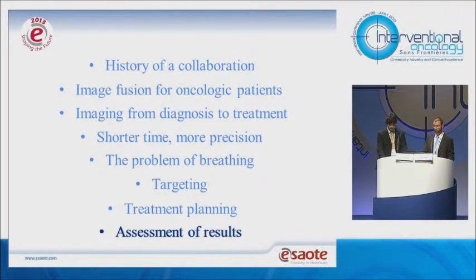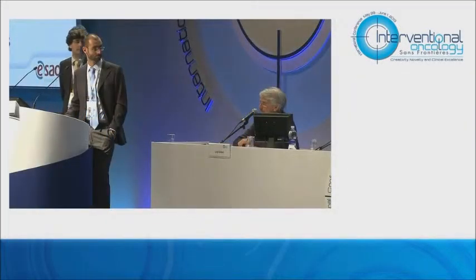Finally, the last point is how we can assess the results of ablation, possibly immediately, because the assessment should be done during the procedure, immediately at the end, when the patient is still in the interventional room or in the operative room. If you assess the result very beautifully, but 24 hours later or 48 hours later, and the lesion is not completely treated, or the safety margin is not large enough, this can be a problem, because you have to recall the patient and retreat the patient.